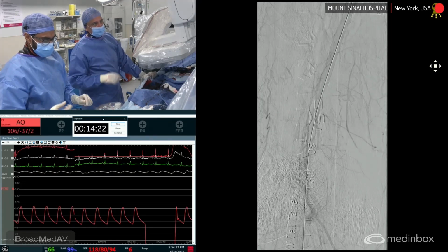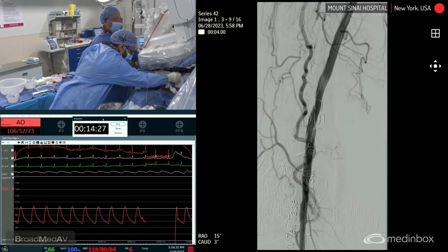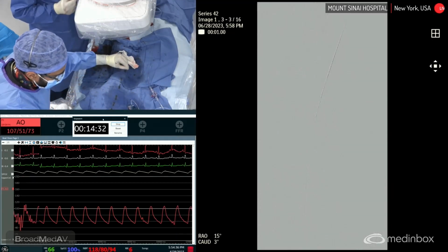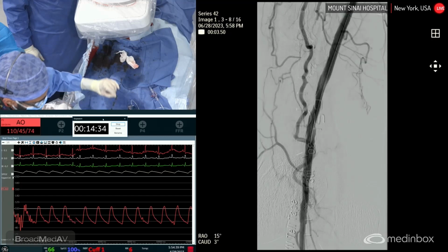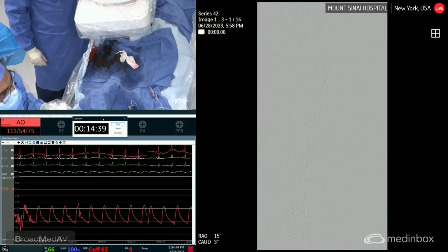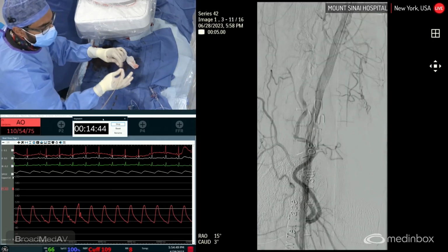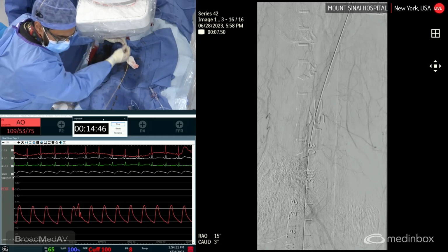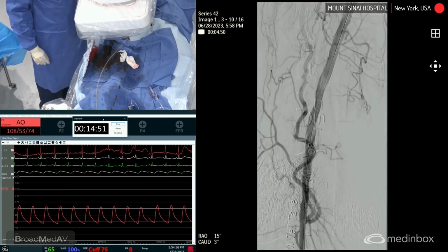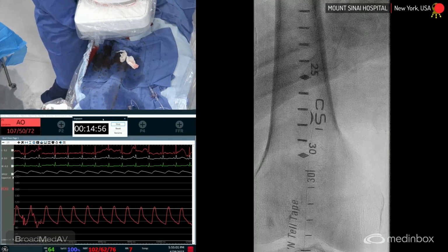It's pretty complex, around 30. All right, so we're gonna go with a Dorado, and then we're gonna balloon it, and then we're gonna go with a Supera, and we'll be done in a sec. So now I've got a command wire down, and I'm just gonna go with a Dorado, and then we're gonna just balloon across the CSI, and then we're just gonna put a Supera there. I think we'll be done in a second. I kind of feel better that I listened to Ibrahim, because now I know I've got good outflow, even though I don't have the data to support it, but it makes intuitive sense.